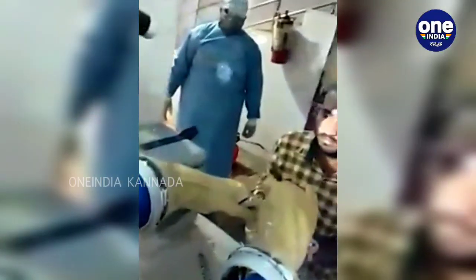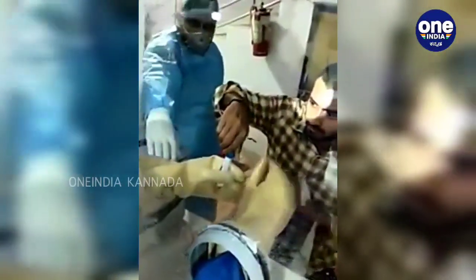The swab is introduced into the bottle having the transport medium, and it is being kept into the container having ice packs. Spraying will be done again to the hands. The person is protected with PPE of the operation theater, and the hands are removed now.